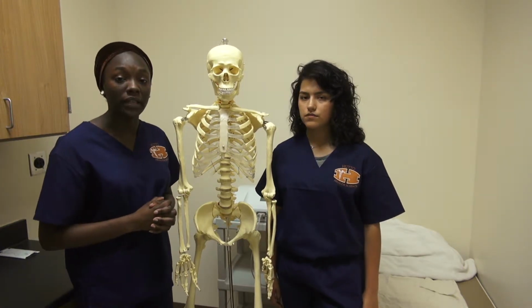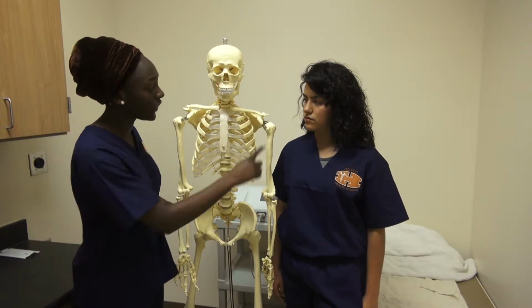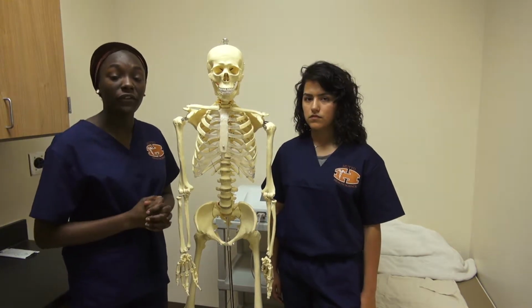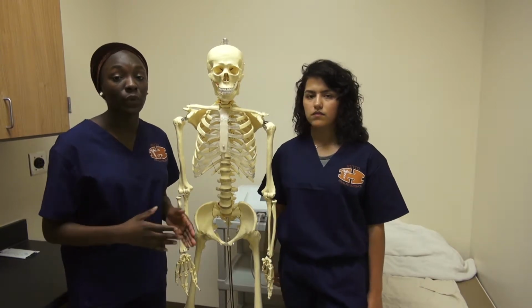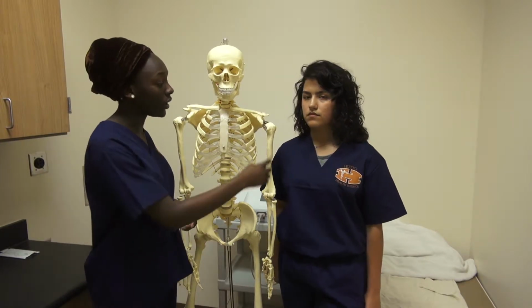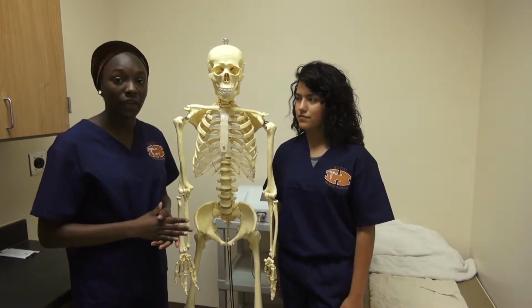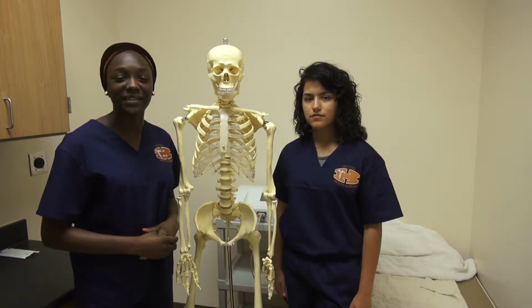V4 is going to be placed in the 5th intercostal space of the midclavicular line. So that would be right here, and you would count 5 intercostal spaces below that. V5 is going to be placed in between V4 and V6, so we will be placing V6 first. V6 is placed on the left side in the mid-axillary line in the 5th intercostal space. After that, we would then place V5, and now you have placed all of your 12 leads.